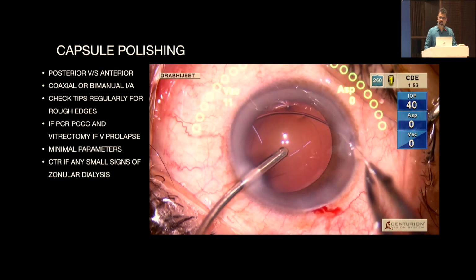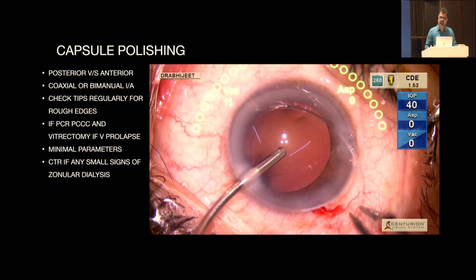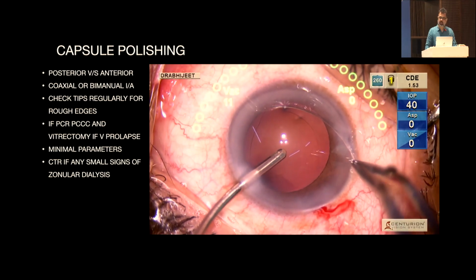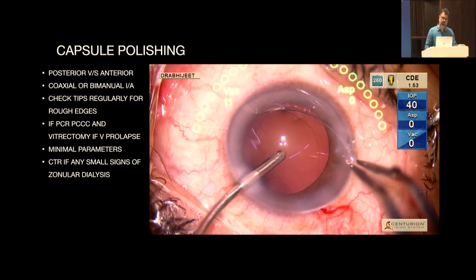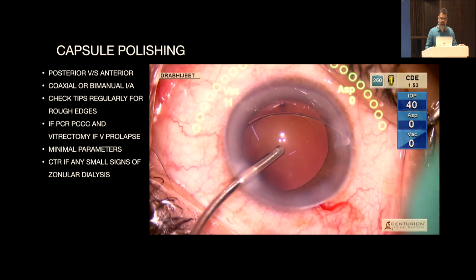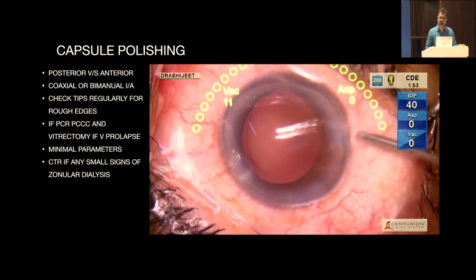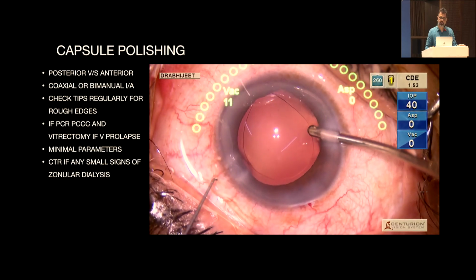There are certain lenses like the Zeiss lenses which are a bit short. So if you have a big bag, especially myopes, and a big wide to wide, you would tend to put a CTR even in these patients, so that the rotation is prevented for the toric IOLs.